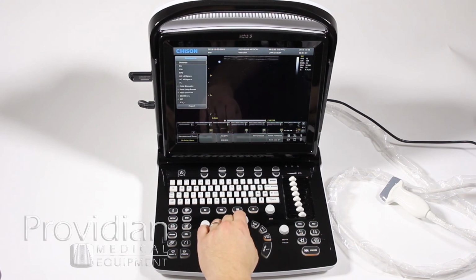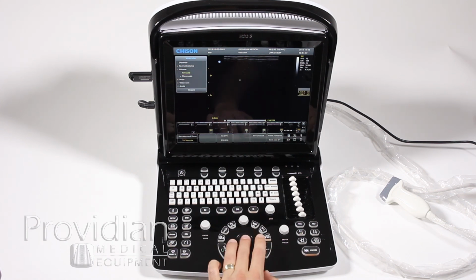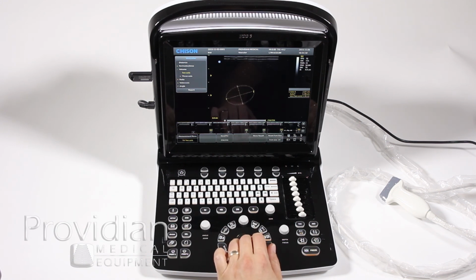You can just go to the vascular real quick. Scroll down, I'm going to select volume, 2-axis, and I can just click here, change, click here, change, enter, and I can make it this way. Hit update again and I can change it, and hit enter, and it'll save.